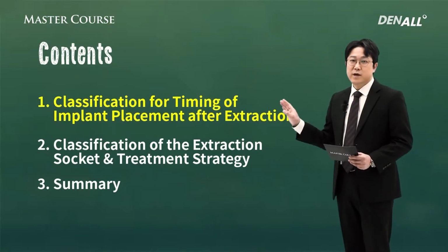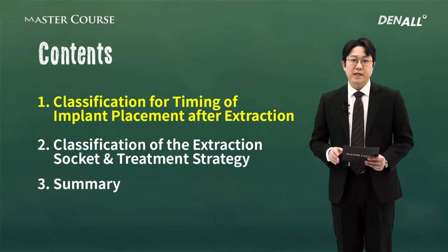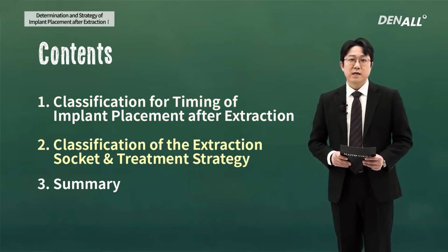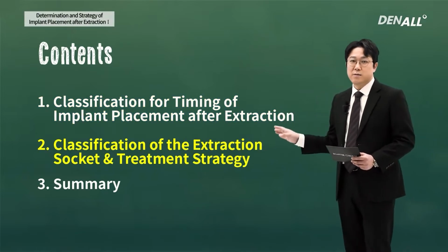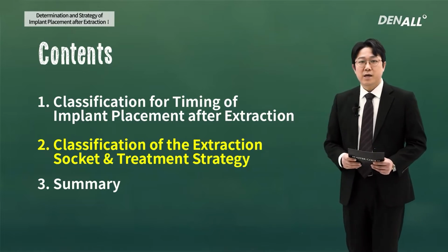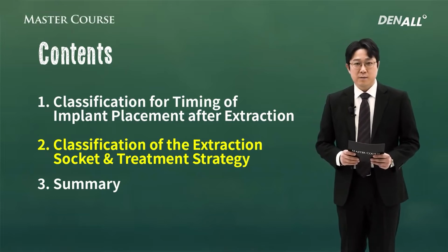First, when you're going to place the implant after extraction, the placement period. Second, in order to determine the period, the extraction socket shape is very important, and the classification depending on the resorption level of the socket and the treatment strategy will be discussed.